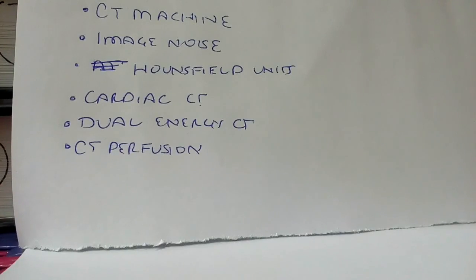And dual energy CT is the one in which there are generally 2 X-ray tubes instead of 1, and generally it gives a higher radiation, but a cardiac CT is always better in a dual source CT. So suppose a 128 slice single source CT takes a cardiac image, and a 64 slice dual source CT takes a cardiac image. The image in the dual source 64 slice CT will be better, because the temporal resolution, which should be a minimum of 0.33 for cardiac CT, is higher in dual source.